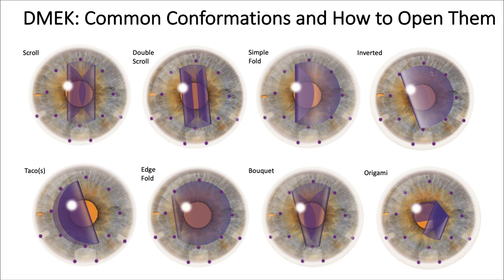We've got to learn these common configurations and how to open them: the scroll, the double scroll, the simple fold, inverted, tacos, edge fold, bouquet formation, and even the origami.